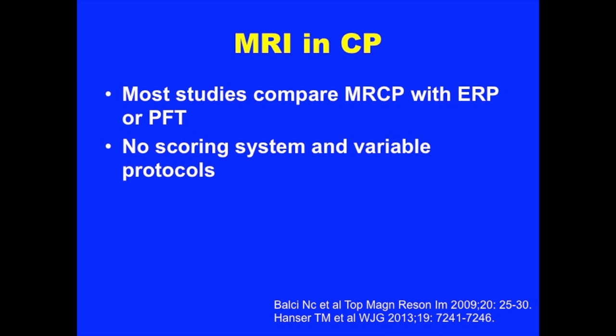Looking at MRI in chronic pancreatitis, we saw a lot of that information yesterday, but not as an insult to our radiology colleagues, we tend to see a lot of pretty slides, but we don't see a lot of comparative studies. We definitely don't often see randomized controlled trials looking at these types of things.